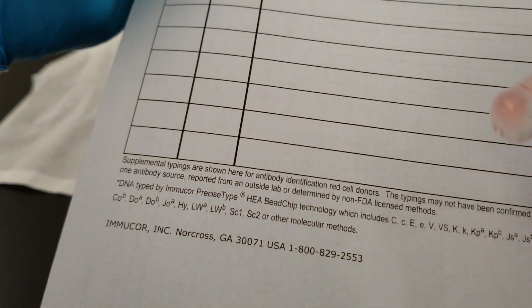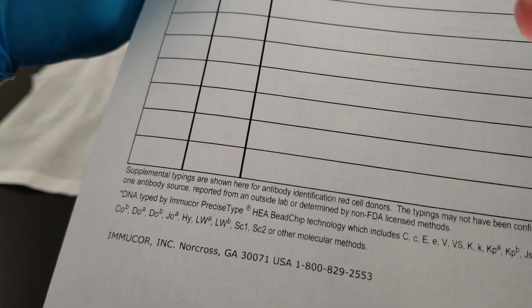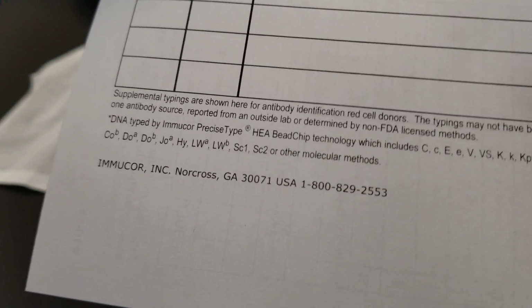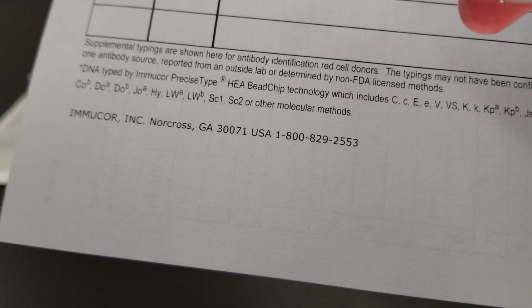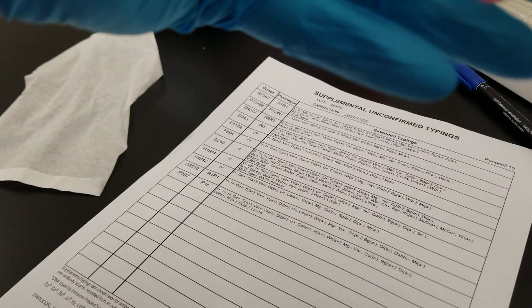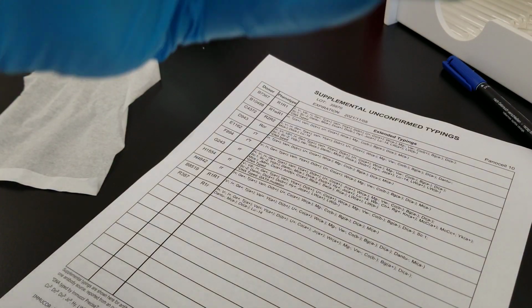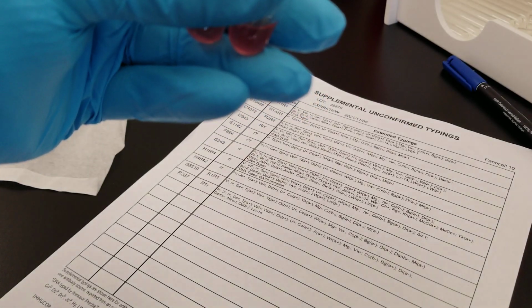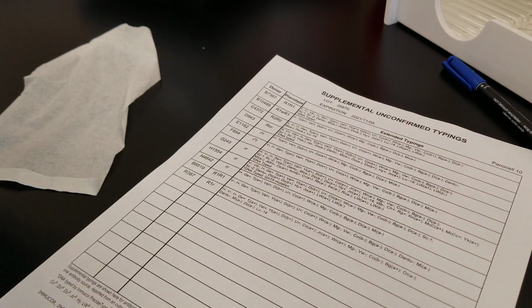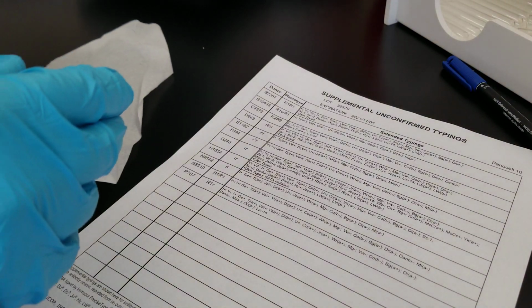Looking at 8 and 9, which are 128. Those are looking negative. Sorry. Yeah, so we're starting negative at 1 and 128. So the last one should also be negative.